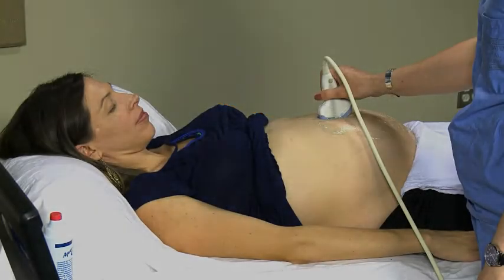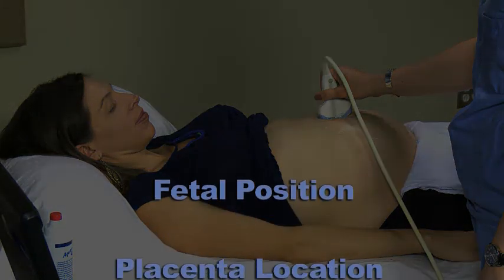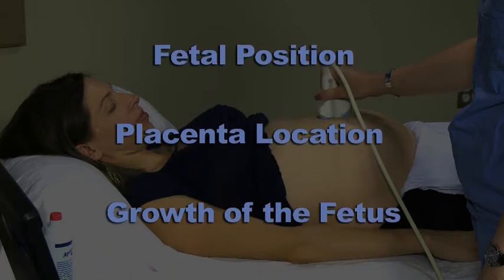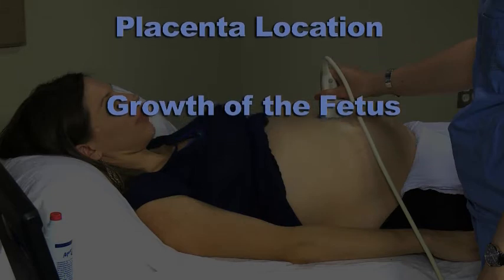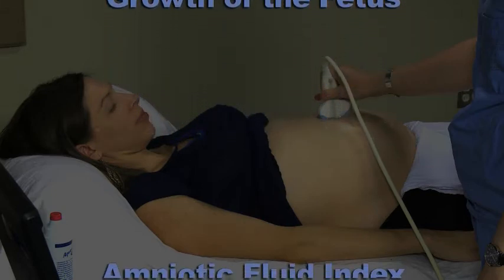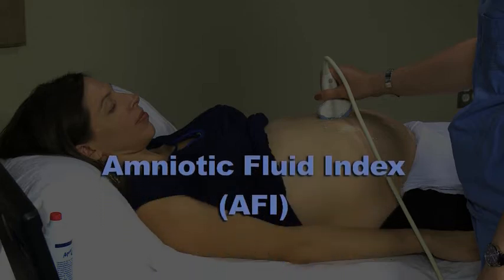At this point, you have already determined the fetal position, placental location, and growth of the fetus. The last thing you will need to do is measure the amniotic fluid around the fetus. The AFI, or amniotic fluid index, is a tool that will help you determine if the fetus is healthy or not.